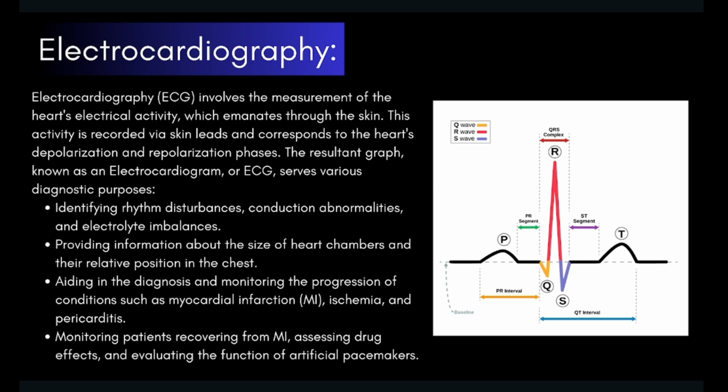So today I'm mainly going to be giving a brief overview of what electrocardiography is and what an electrocardiogram is. So electrocardiography involves the measurement of the heart's electrical activity which emanates through the skin. This activity is recorded via skin leads and corresponds to the heart's depolarization and repolarization phases. The resultant graph, known as an electrocardiogram or ECG as well, serves various diagnostic purposes.